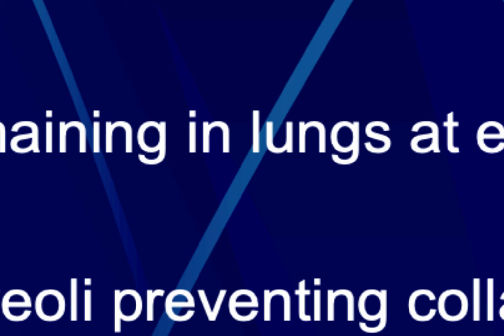And I think the machine itself really is like a warm blanket for some patients, right? Especially if you guys are able to make the patient understand exactly what this machine is going to do before you put it on, right? And as soon as those patients take those nice first couple of deep breaths, that work of breathing really goes down, because they realize how much that machine is actually beneficial to them during whatever crisis they were dealing with at that time.